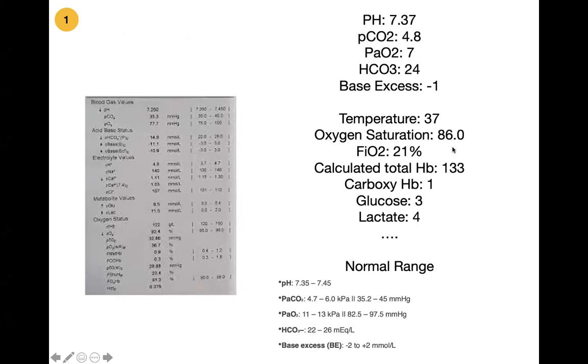It gives you lots of other information. And just to quickly mention as well, it gives you that oxygen saturation, more for real life. Often you see a number and you're like, oh, that's worrying, but you want to know, is this actually an ABG sample, or is this a venous blood gas sample, in which case that's a lot less worrying. We don't need to worry about that. And often you should look that the PaO2 should be correlating with your oxygen saturations.